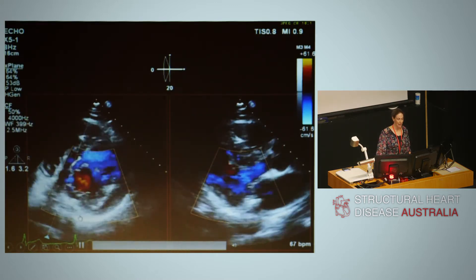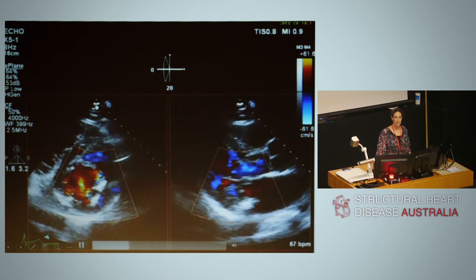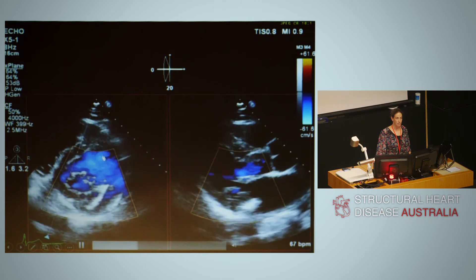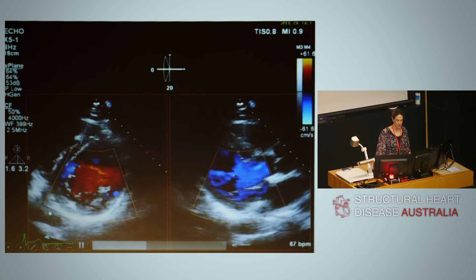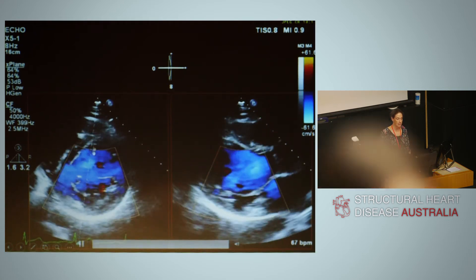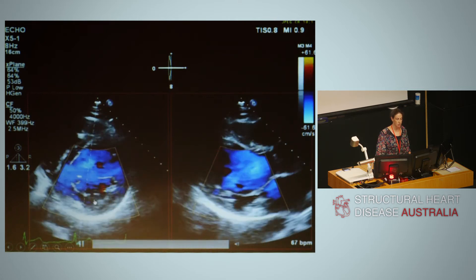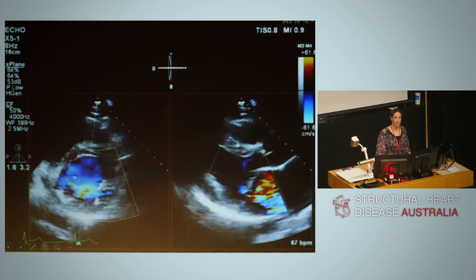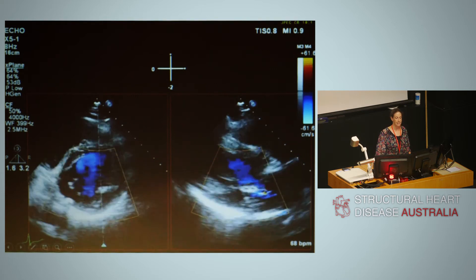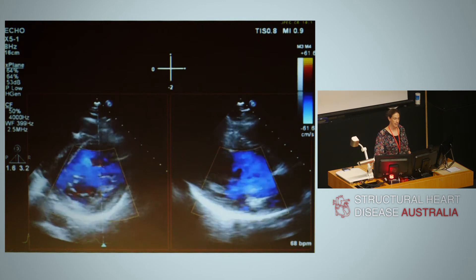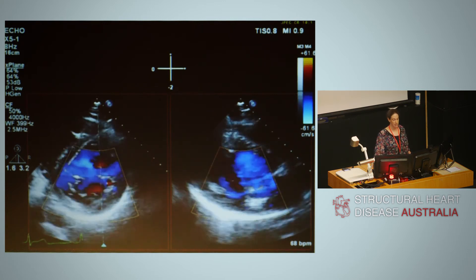If you have the luxury of biplane imaging, this is very helpful. We're sweeping through from the medial portion of the valve across to the lateral. With biplane imaging, we're seeing a short axis view through the medial aspects, A3 and P3, and the corresponding long axis image. There's little mitral regurgitation at this point. As we sweep to A2 and P2, there's more regurgitation, visible in the parasternal long axis image, with the jet arising centrally. Moving to the lateral aspect, there's less regurgitation. This 3D biplane imaging helps localise the jet origin and assess severity.